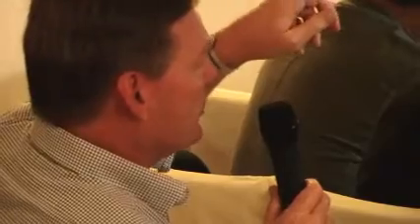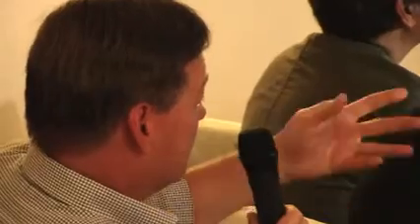In those first algorithms you showed, when you came to a lesion that you thought was indeterminate, you had the arrow going to biopsy. Sorry, which algorithm? Well, the ones that you showed right at the beginning about workup of lesions. The question I'm asking is, if after contrast enhanced ultrasound you're pretty confident that the lesion is malignant on the characterization of the lesion, are your clinicians in the institution where you work happy to accept that without a biopsy, or do they still want histological confirmation of it?